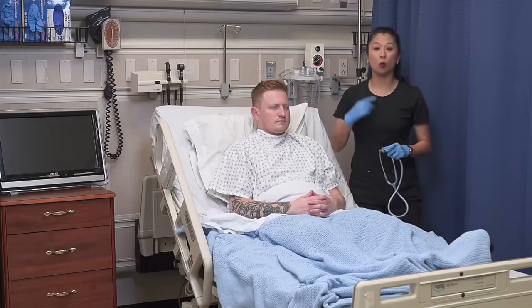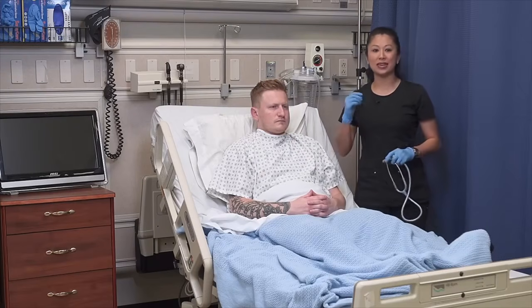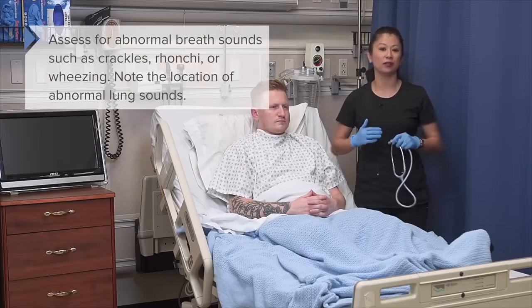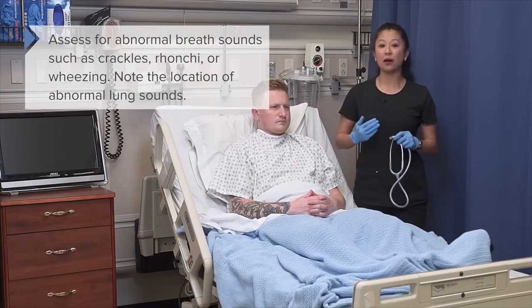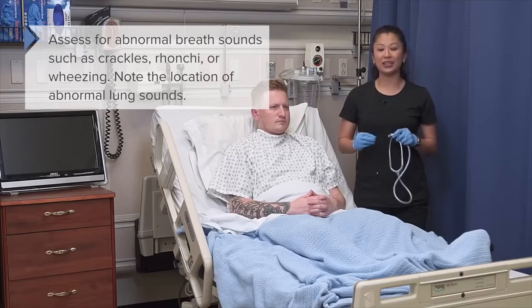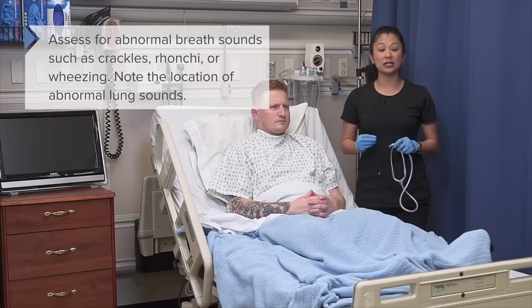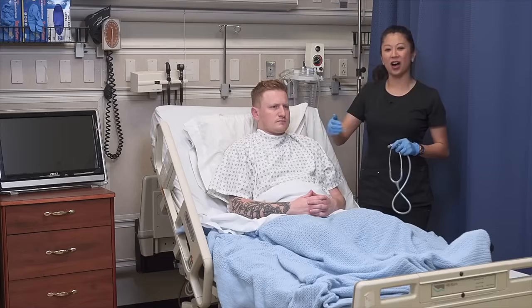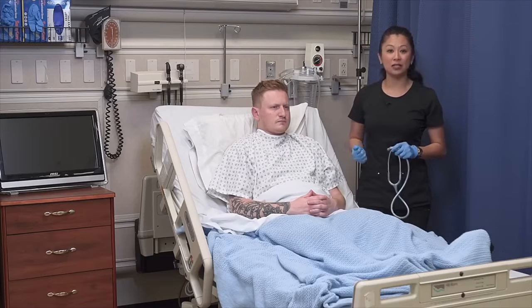So you want to know when you're listening, is there anything crackly sounding, kind of like Rice Krispies, or any sort of high-pitched abnormal sound like asthma. Anything abnormal you want to document and also report. Now I'm going to show you how we're going to auscultate the front and the back of Brandon's lungs.